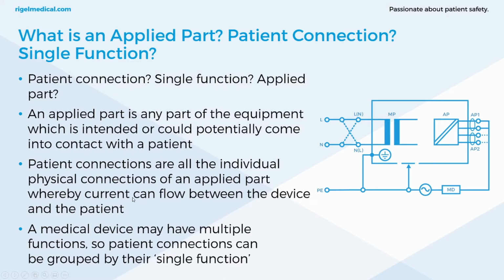So these two are important terms to understand, and it will become more apparent when we look at the testing of other devices such as infusion. So there is a difference between these. The standard explains it in the best way possible, but in our example it explains it even better.